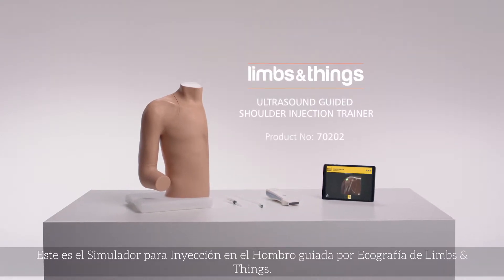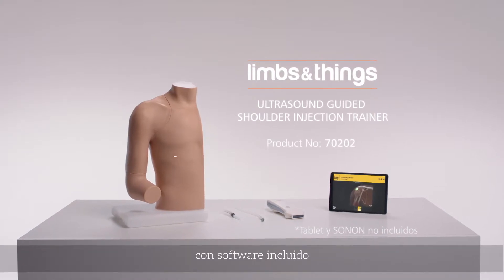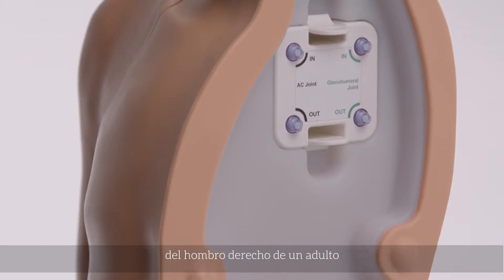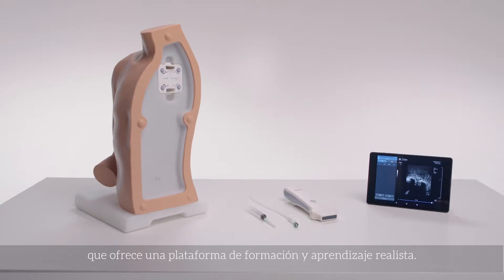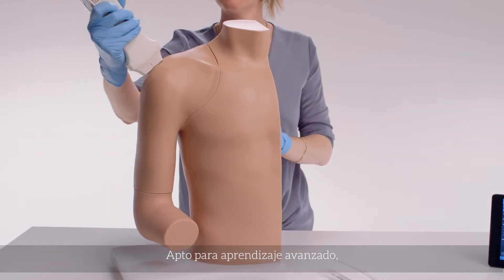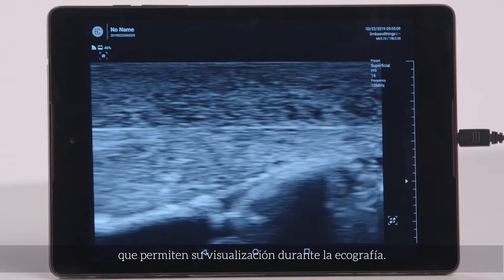This is the Limbs and Things Ultrasound Guided Shoulder Injection Trainer with Companion App. It is an anatomically correct adult right shoulder that provides a realistic teaching and training platform. Suitable for advanced learning, the shoulder features key internal landmarks that are visible under ultrasound.